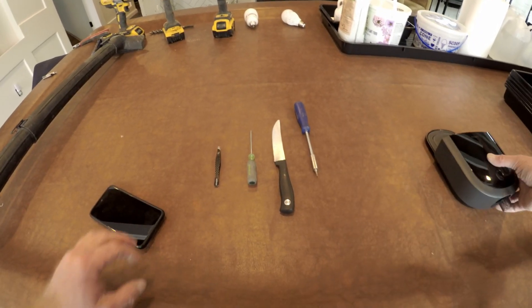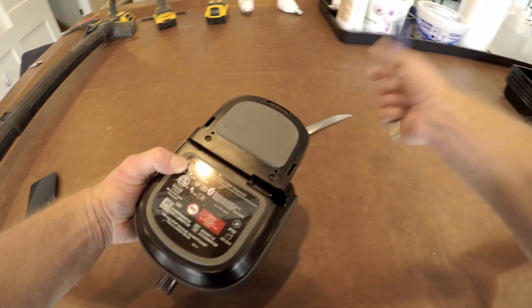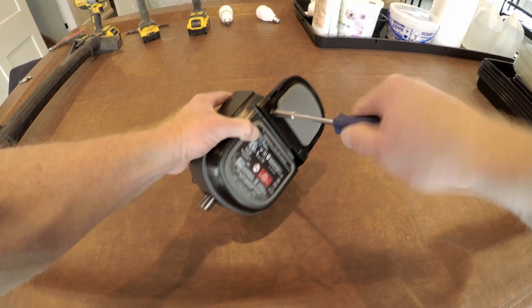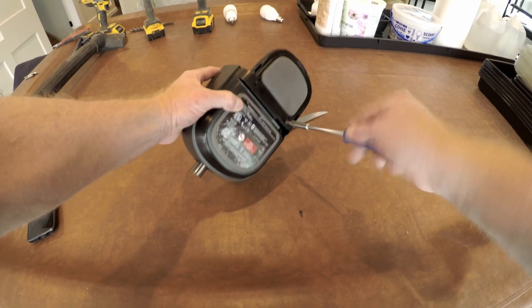The tools required to do this are a crusty old knife with a halfway sharp blade, a Torx driver with a pretty small tip, and a pair of tweezers. On the bottom of the CPAP machine, there are two screws that are easily accessible to pull out. That's where we get started.